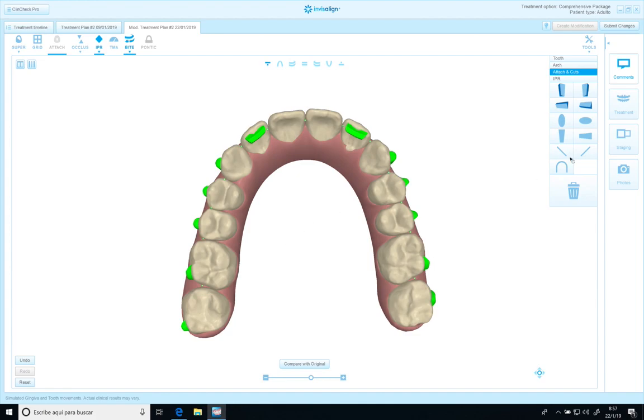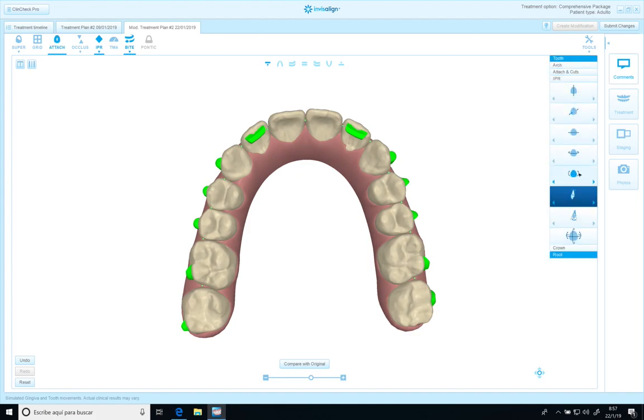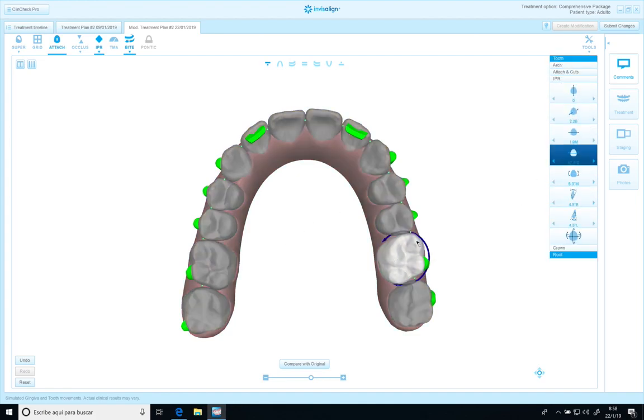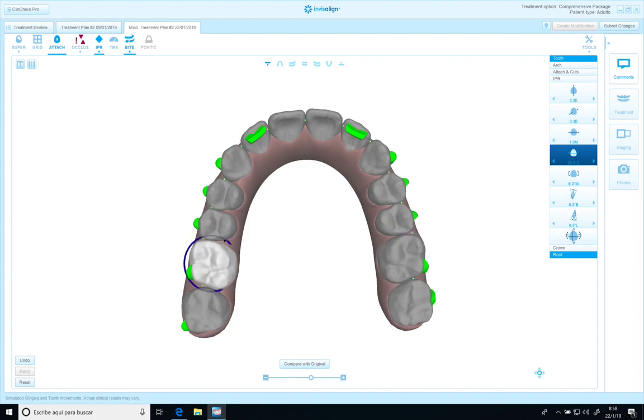Something I also want to change is the rotation of molars, and also this one.